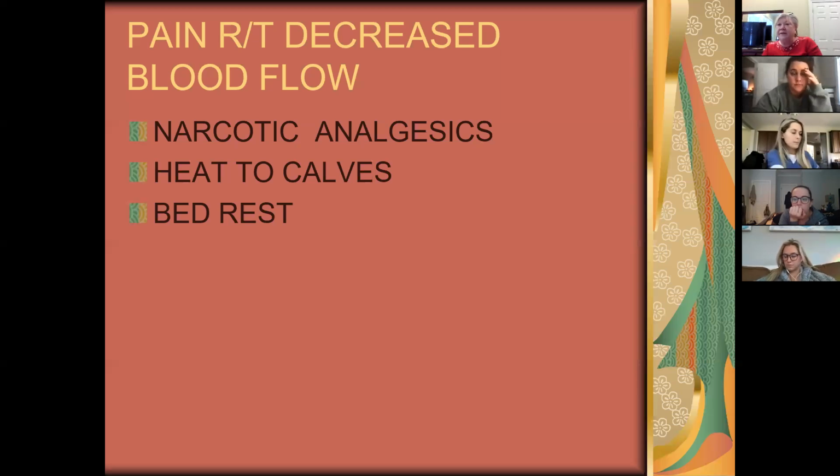But usually, on the end of a hyperalimentation or going through a central line, they're there as bubble catchers. That's not an IVC filter. That's just a different kind, like a filter for blood. That's for catching clots when you're giving a blood transfusion. So that's different than an IVC filter.